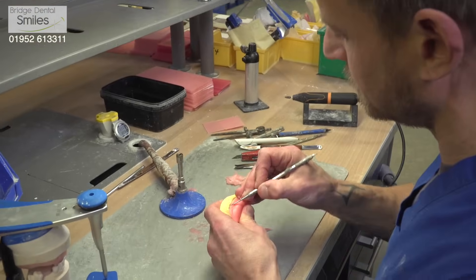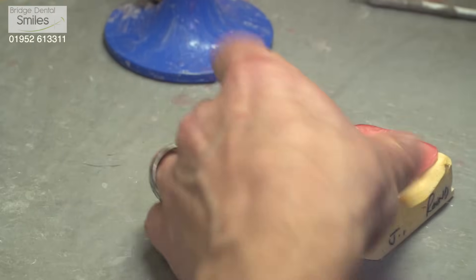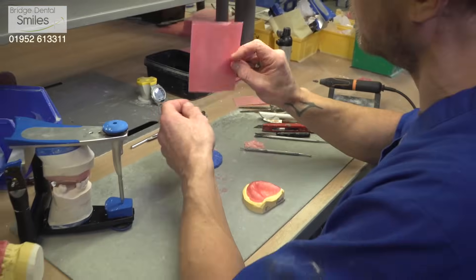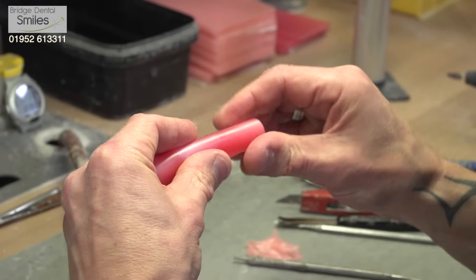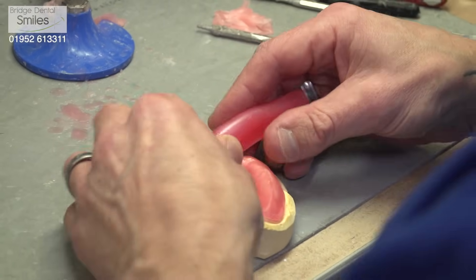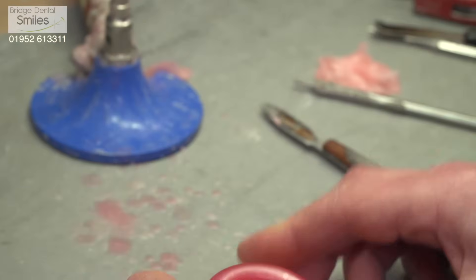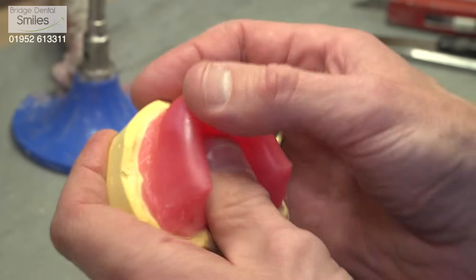We're taking the wax off the muscles now — you can see the shape arriving. Then a much larger sheet, which is going to form the rim that builds up the height. This takes the place of the teeth and gives us the height distance between the upper jaw and the lower teeth. Squash it round to the shape of the arch, making sure there's plenty of adhesion between the upper rim and the base plate. That's the basic shape form — just need to cool it down and then work with a wax knife to get the shape correct.